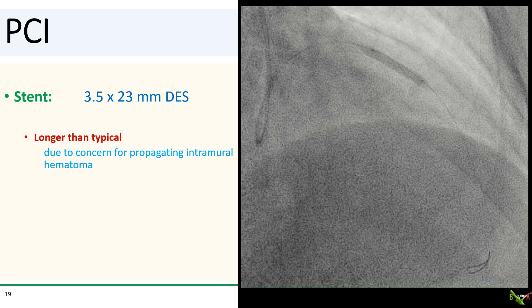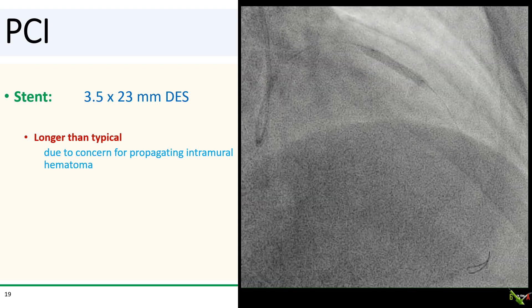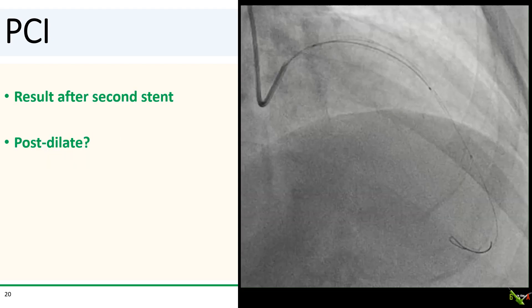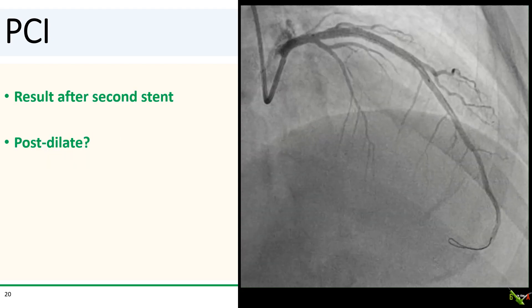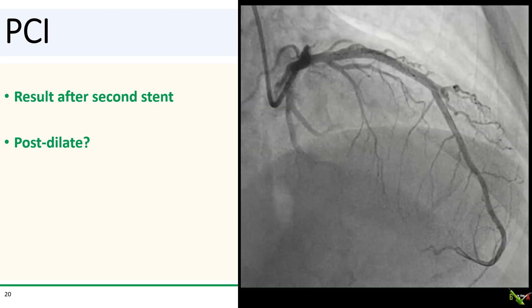We deployed an overlapping 3.5 by 23 mm DES. We intentionally chose a longer stent to make sure it lands in distal healthy tissue and to help pin down any intramural hematoma. We had a reasonable result after the second stent.